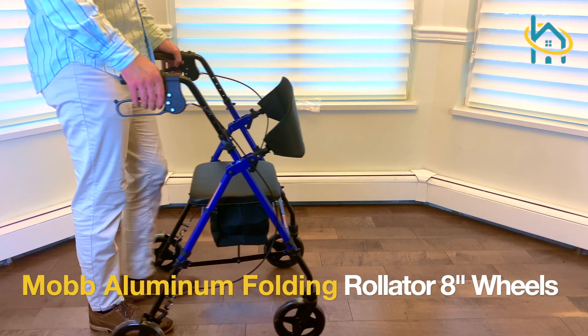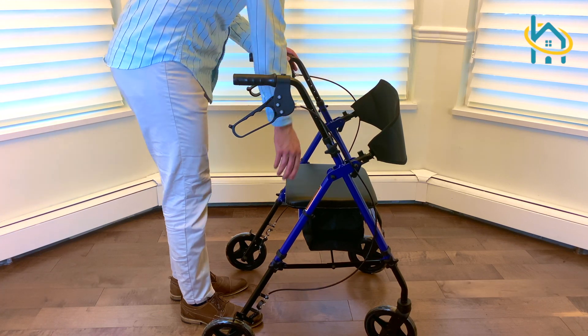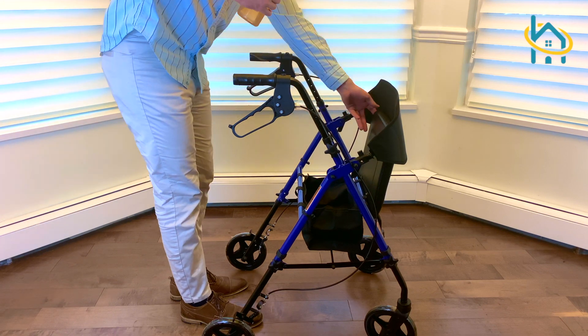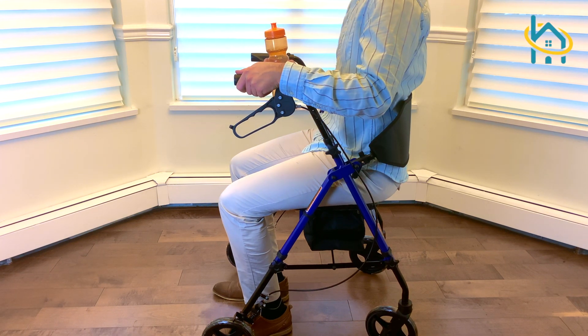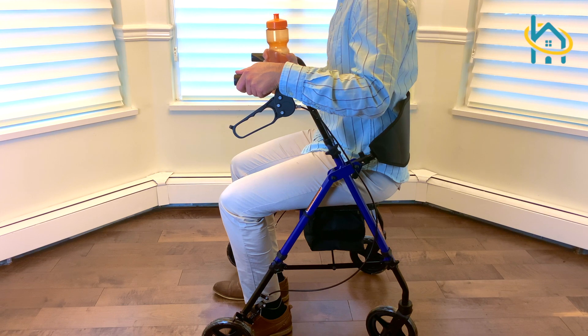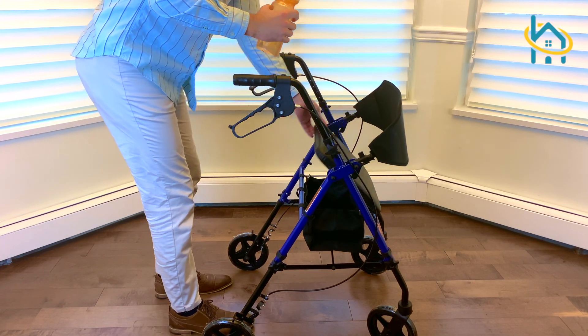The MOB aluminum folding rollator with 8-inch wheels is ideal for patients who require a walker that provides maximum balance and support. The cushioned seat of the rollator is great if you need to take a short break from walking. Additionally, if you pull up the padded seat, it will reveal a spacious built-in storage that you can use to carry a water bottle or some basic necessities when you're on the go.